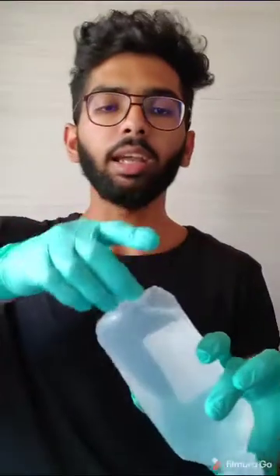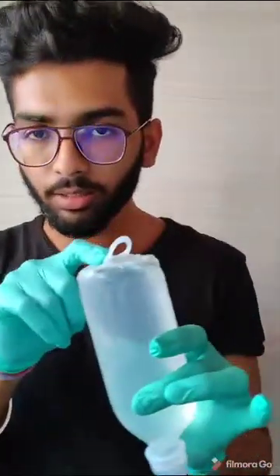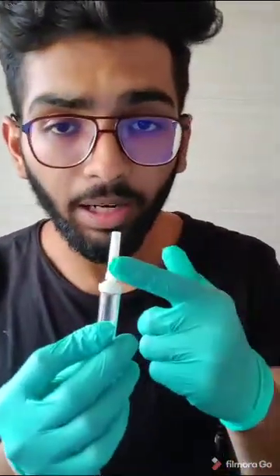As we are done wearing our gloves, we need to first set up the solution. Ideally, this needs to be on the stand, and there is a hook for keeping it on the stand. This needs to be like this. We'll uncap it. Then we'll get the infusion set and use the spike part.